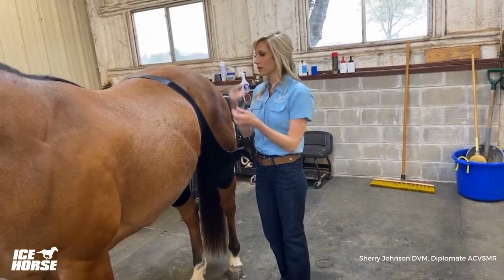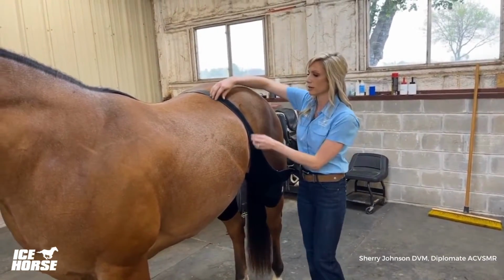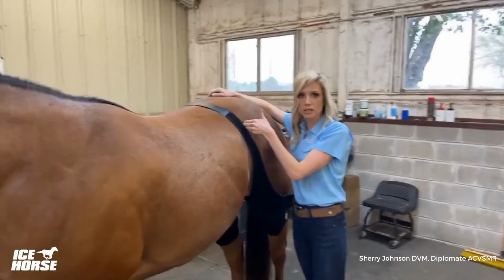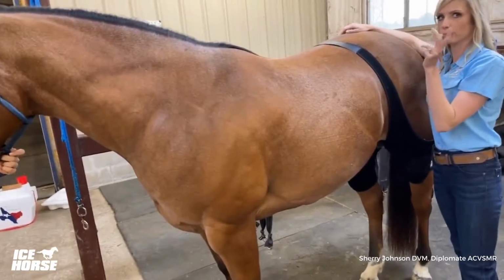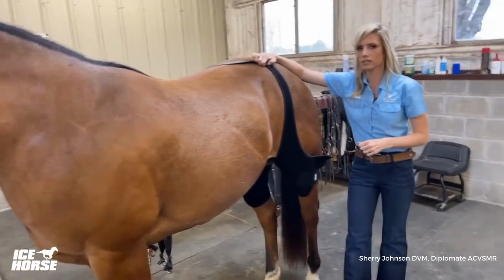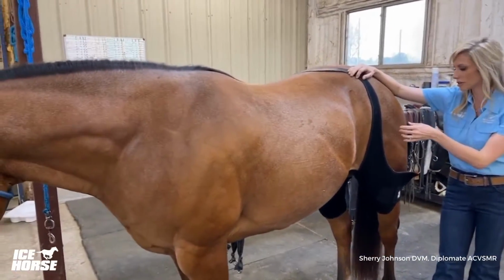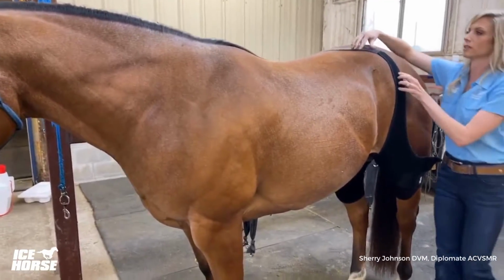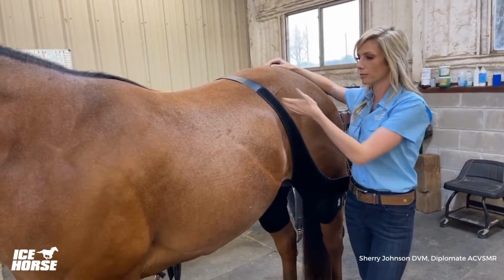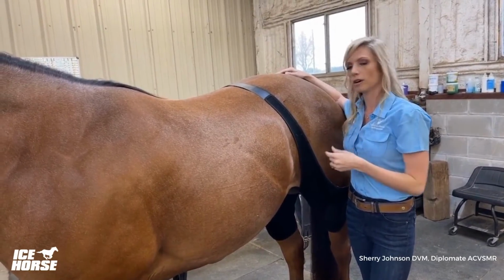The other thing to mention is that for the best fit, so they're not sliding or gapping, I always make sure that the suspenders are pulled in front of the tuber coxae. So this is the actual hip bone region. But you can see that if we pull that back, and it's not seated correctly, then the ice is going to shift and it's not as comfortable for the horse, and it's just not as good of a fit. So you want to have that pulled up in front. The ice wrap is meant to sit in this location exactly so that it's the best anatomic fit.